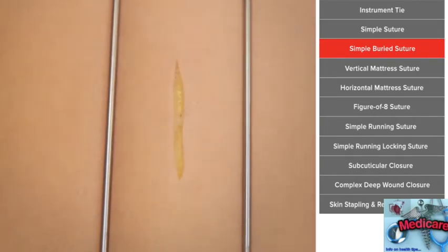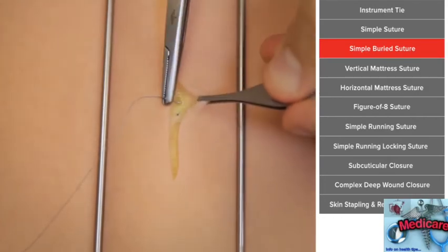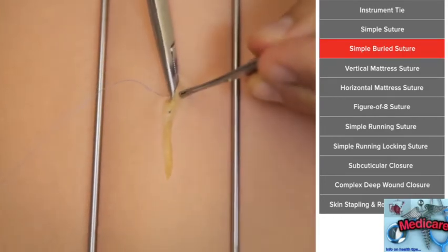And this is important because we want to take all the tension off the skin, whether we're steri-stripping it or whether we're just closing it with another suture, and we don't want these little ends of the suture to poke up through the skin. We call that spitting.